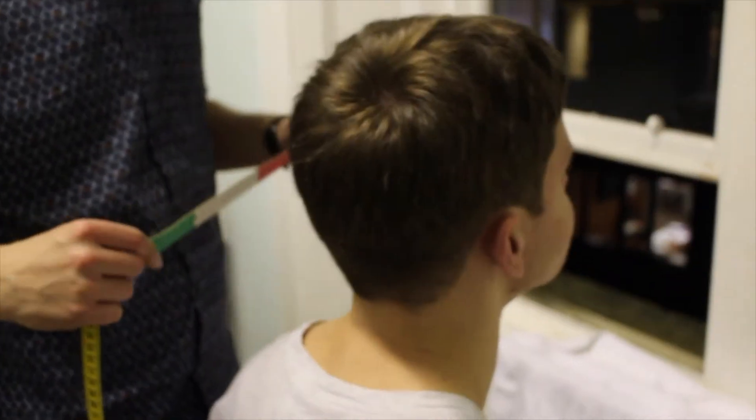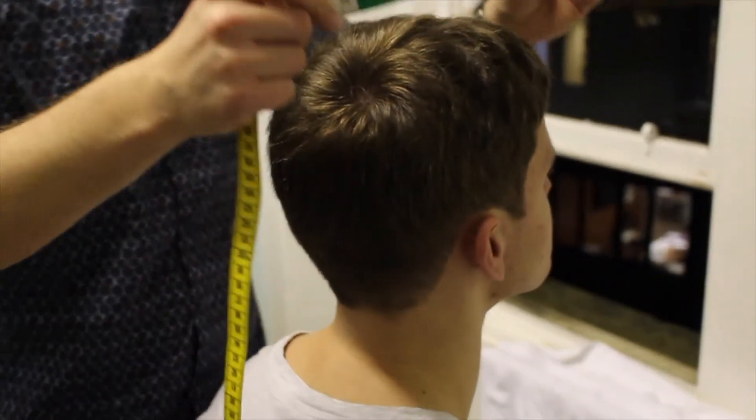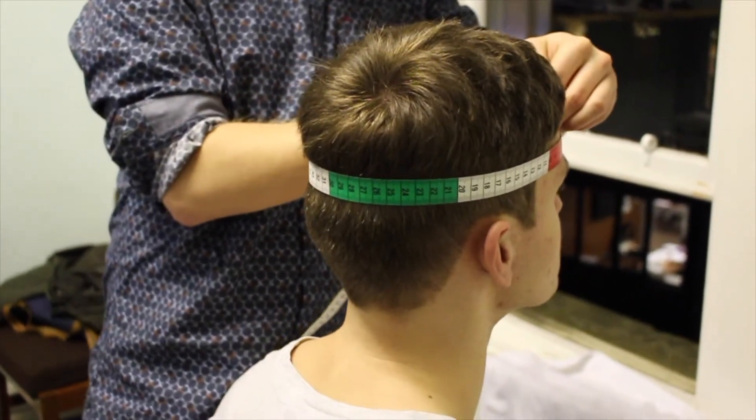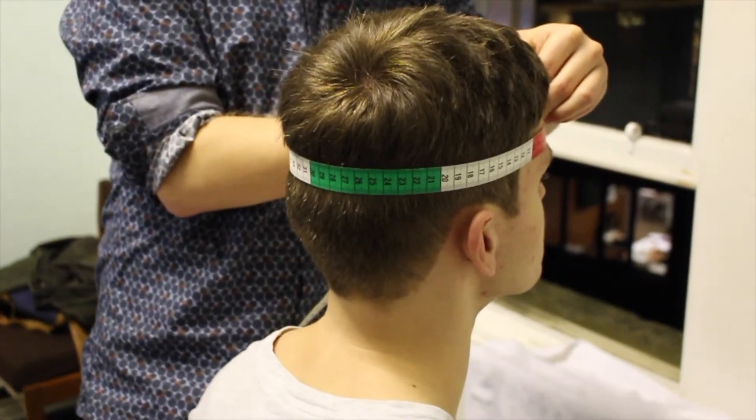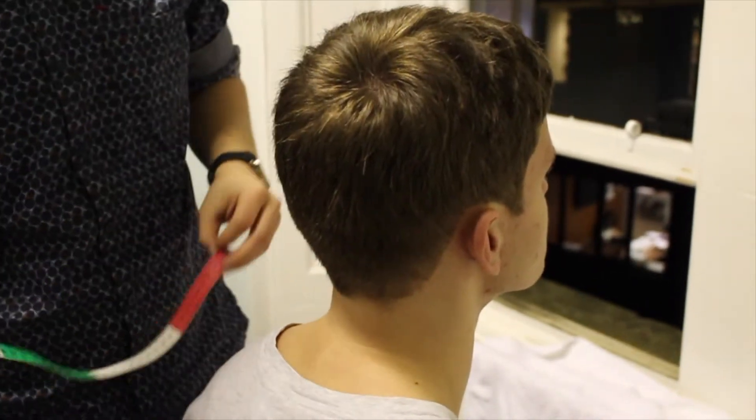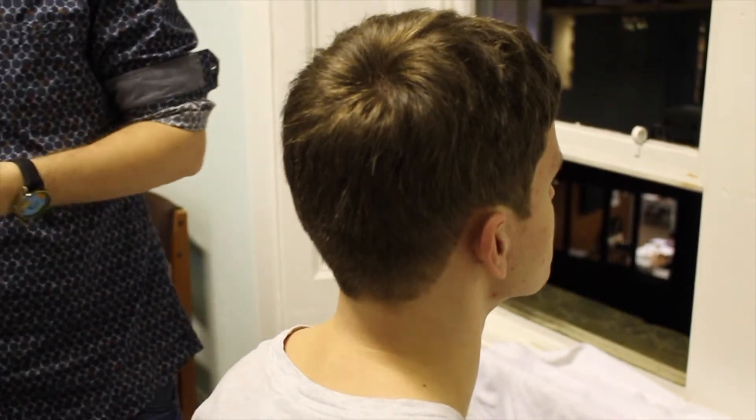Seat the participant with enough space for you to move around them and measure around the head to check which size cap you will need. 54, 56, and 58cm caps are available, and should the participant's head measure as exactly one of these sizes, you should consider trying the next size down.